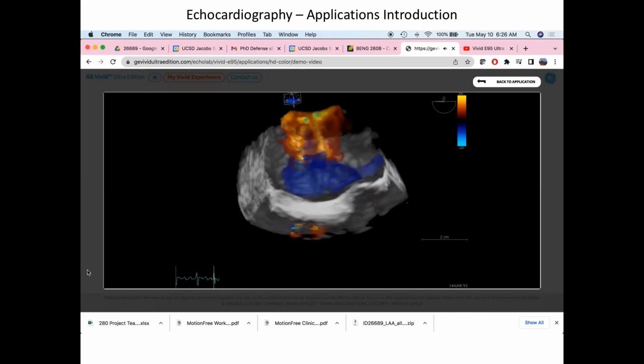That screws everything up, right? That screws up this type of acquisition, because each beat, if you give the heart twice as much time to fill, it will change its end diastolic geometry, right? It'll look like a different object on each beat. And then if it ejects really quickly after the previous beat, it doesn't have enough time to fill, so it's a smaller object when it ejects. The ejection will be smaller, et cetera, et cetera. So yeah, in atrial fibrillation, this becomes quite hard. At that point, you want to revert back to real-time type of stuff or single heartbeat imaging.